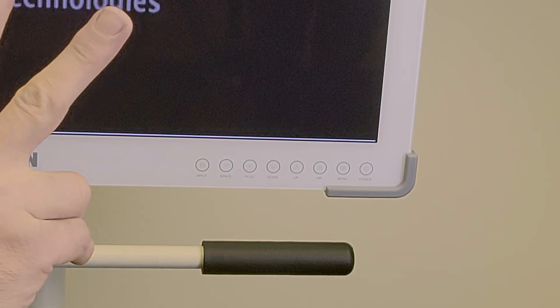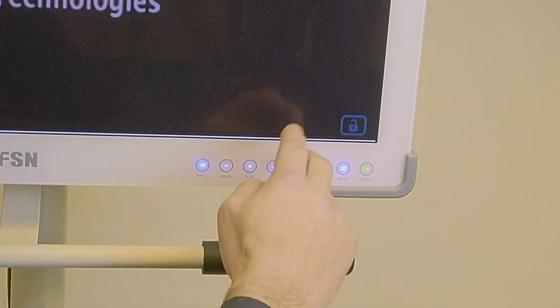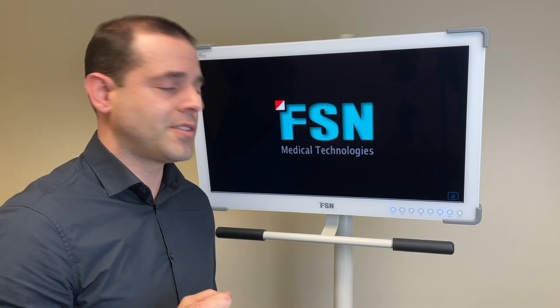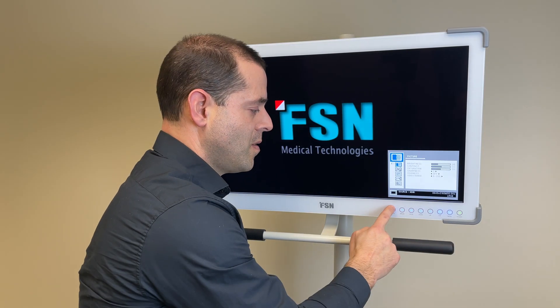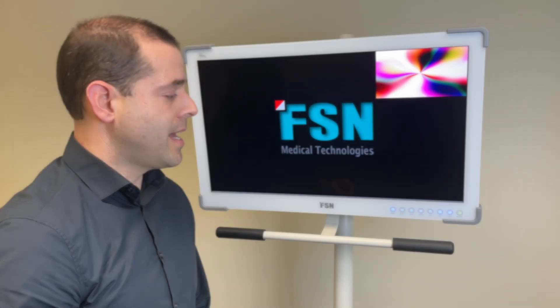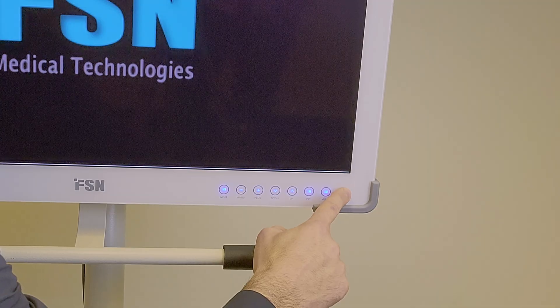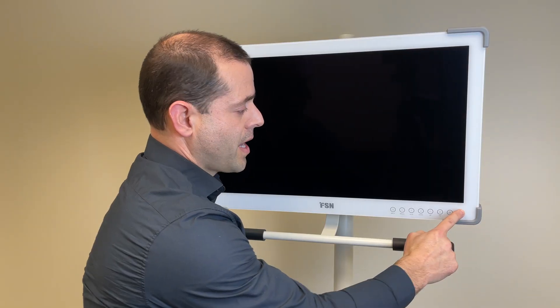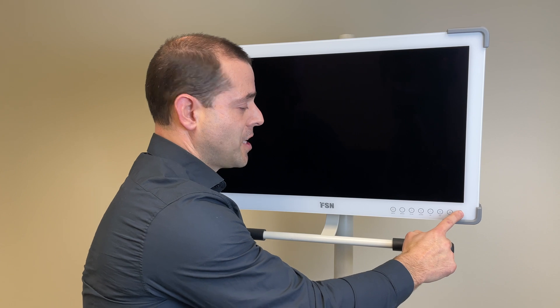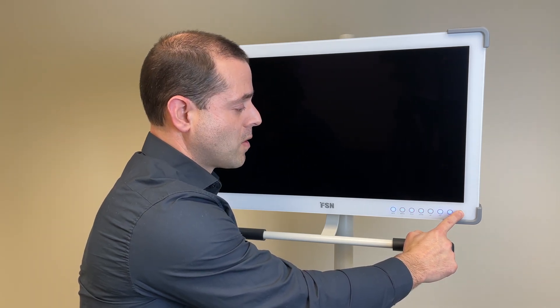To unlock it, two fingers again — it's now unlocked. You're free to power off, press menu, change inputs, etc. at will. And last, the power button: hold it and it goes off. To power back up, same thing — hold it and it powers up.